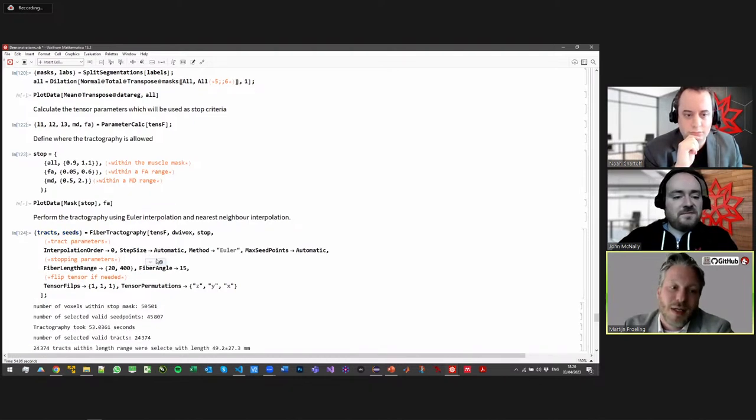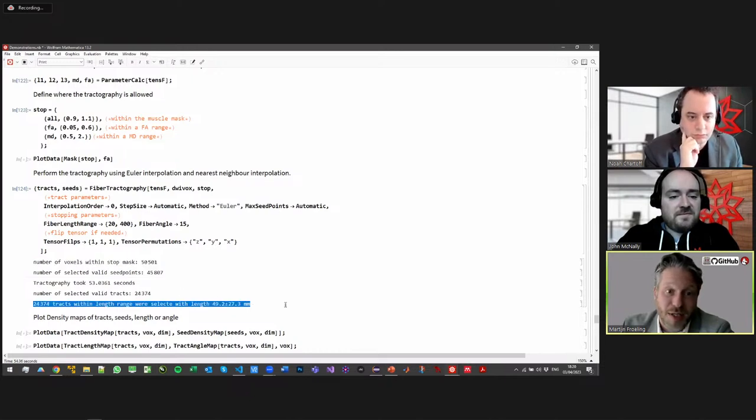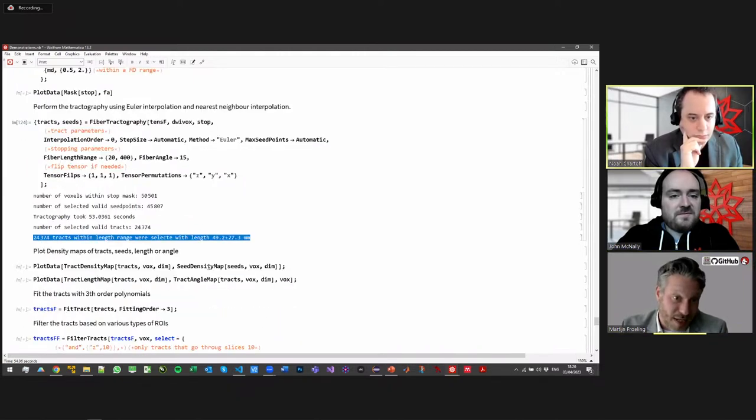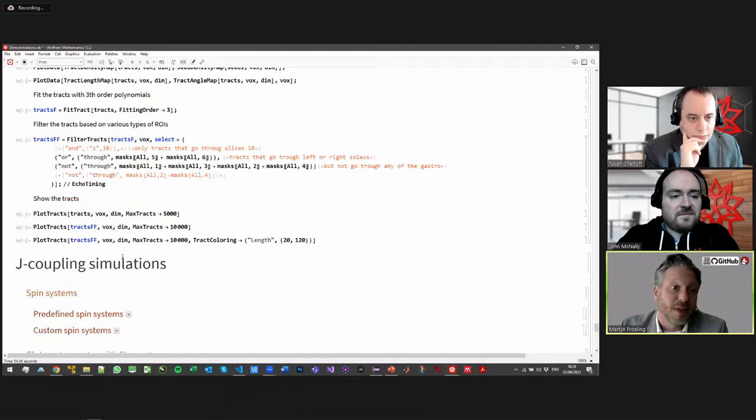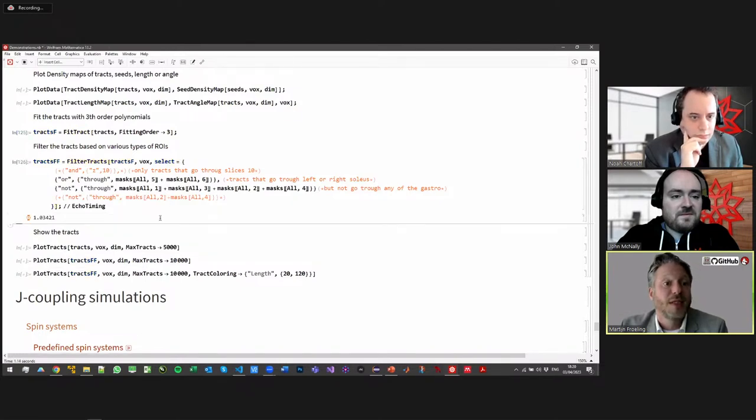So here I do care about time. This took 53 seconds. I started 50,000, and 24,000 of them were valid. This is the average length it generated. Then I'm going to filter it a bit, and then we're going to select some specific tracks. So if I look at the tracks, I'm going to plot 5,000 of these 24,000 valid ones.